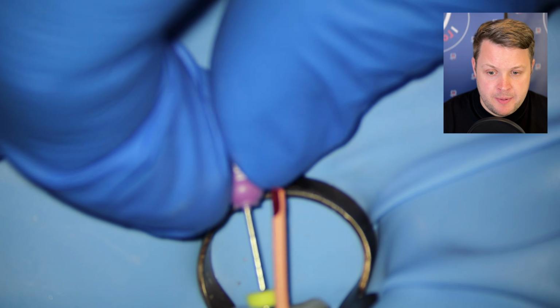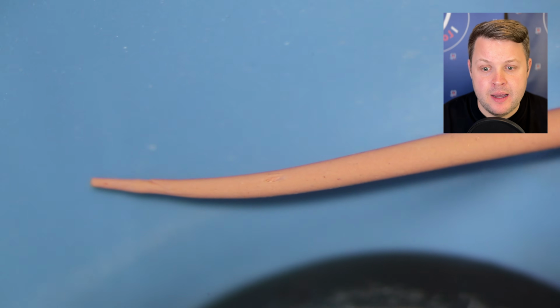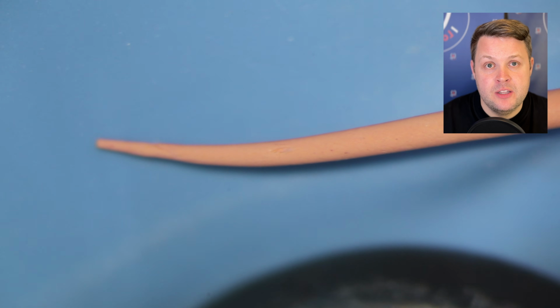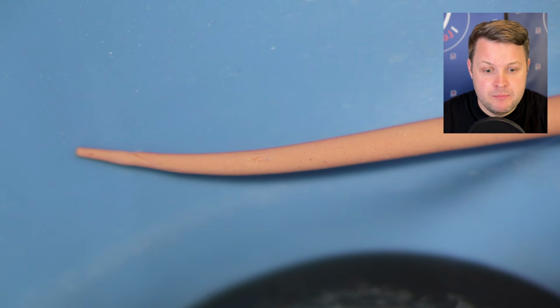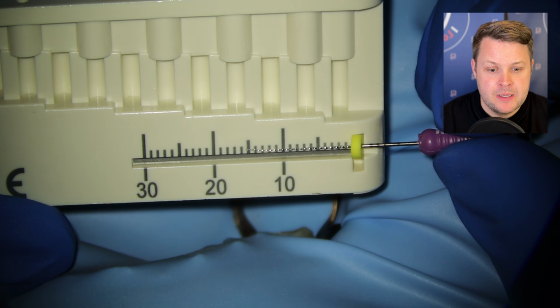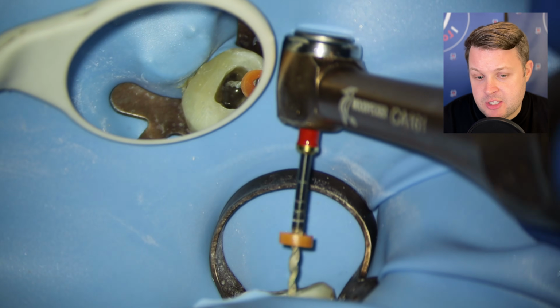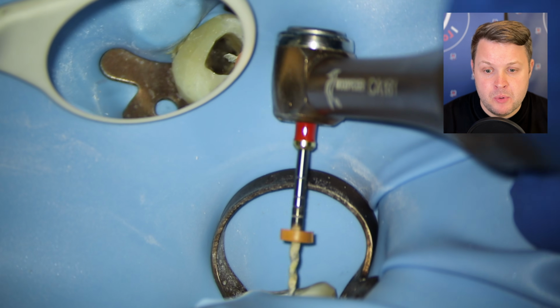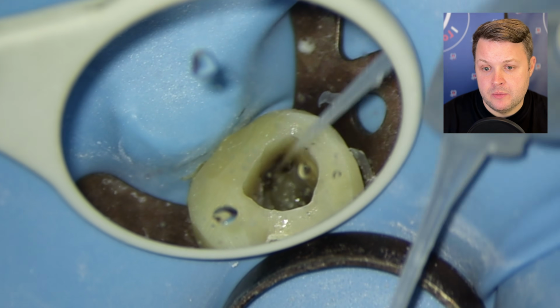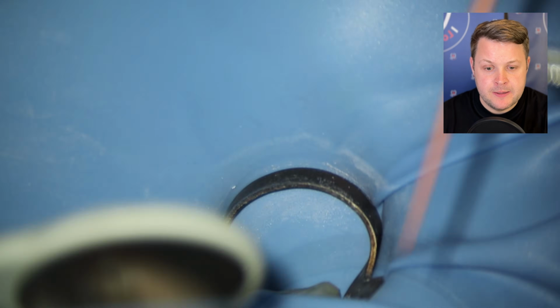I'm going to adjust the stopper, and as we pull the GP cone out, we can see that a mark has been made on the GP cone, and we know this is the point at which the two canals join. And in fact, because we moved the rubber stopper with the hand file, we can see that they join at 16.5 millimeters in the MB2. So this is great. We know where these two canals join, so I'm just going to use a size 25 variable height flex up to this point, and this is all of the canals shaped successfully. Arguably one of the hardest points of the root canal treatment is all completed.